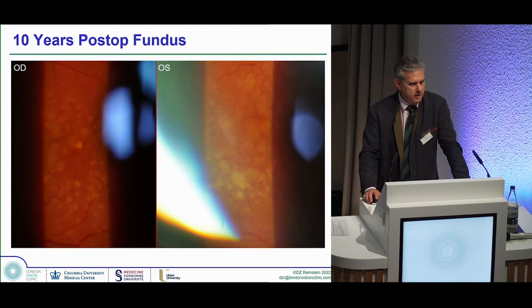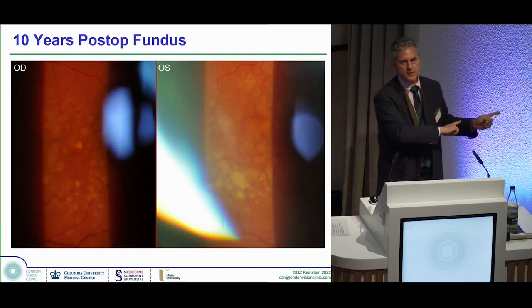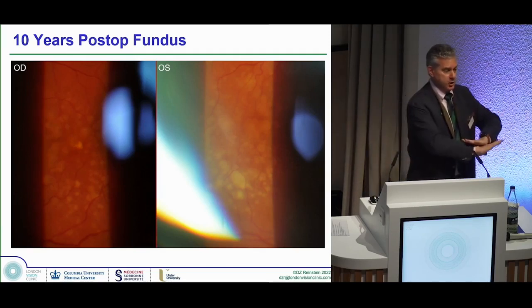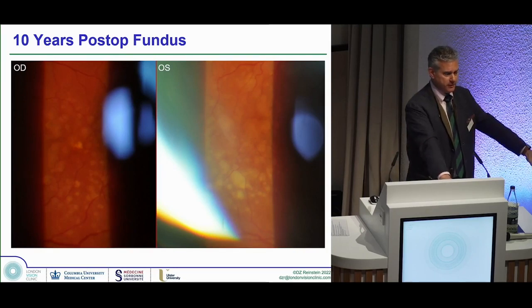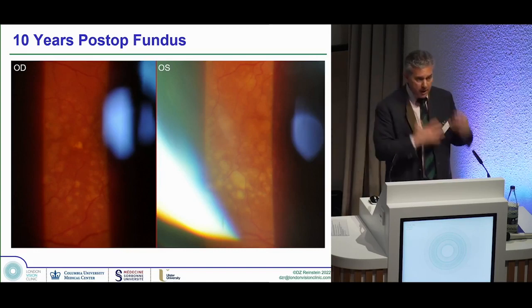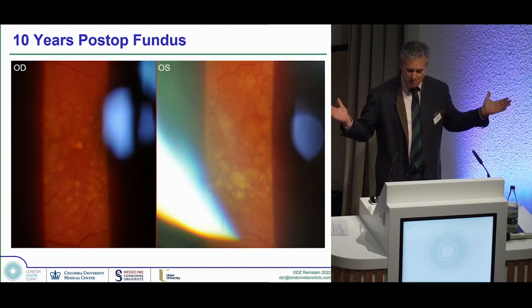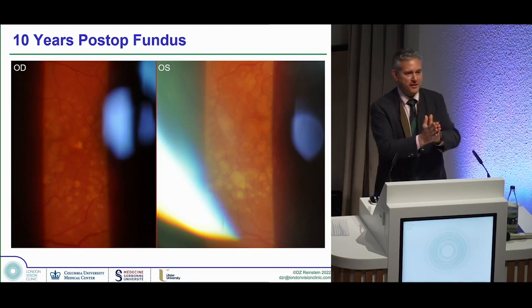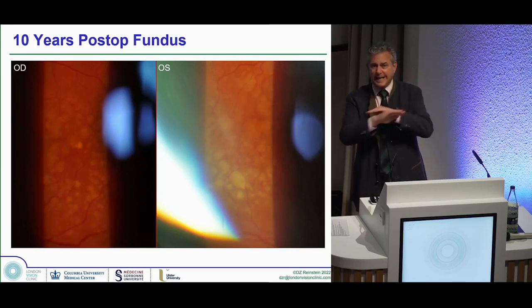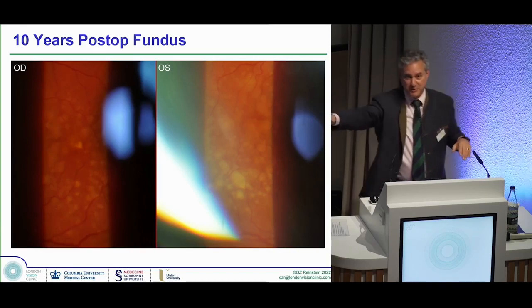Wow. So, someone would have taken that woman in her 60s who's plus and said, laser can't treat plus, and you can't do LASIK in people over the age of 50, and this is the best procedure and it's the only procedure for you, and done a clear lens exchange with a multifocal, because that is bread and butter for a plus 3 or 4 62-year-old, right? Or 60-year-old, right? Bread and butter, classic case. You've seen thousands of them, you two up there, thousands of those, right?